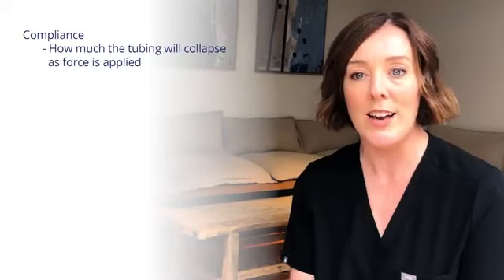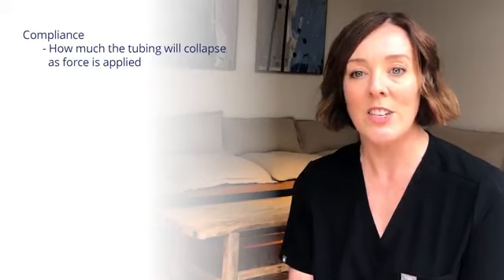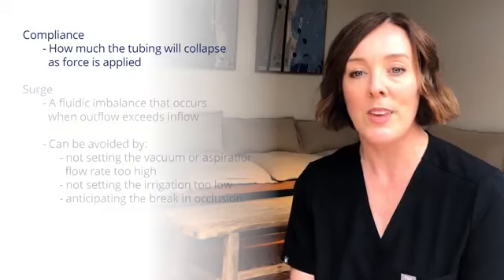Some terminology that's important to understand includes compliance, surge and rise time. Compliance relates to how much the tubing will collapse as force is applied. This has an effect on the degree of vacuum possible and the level of post-occlusion surge.